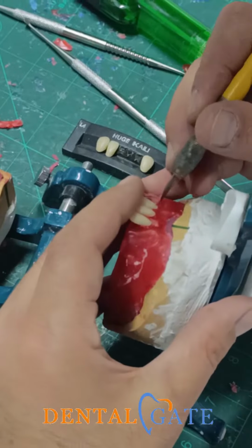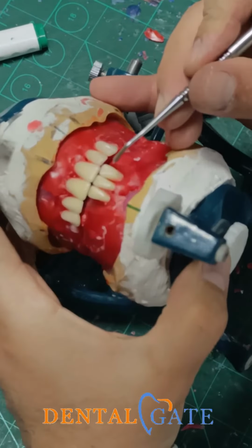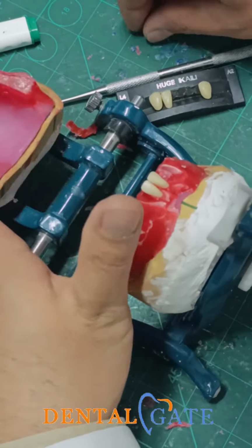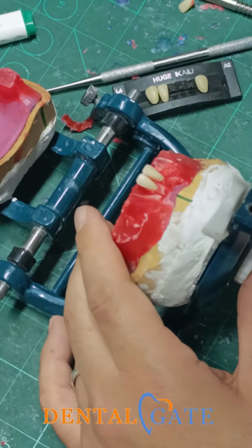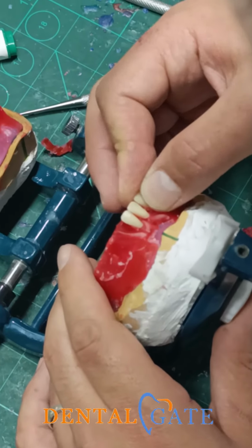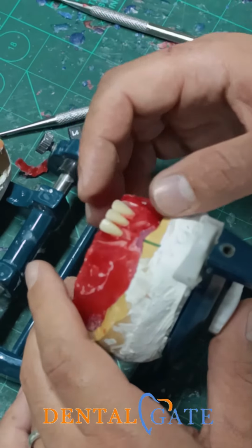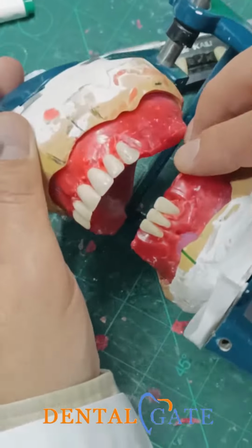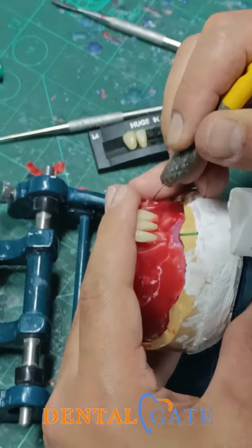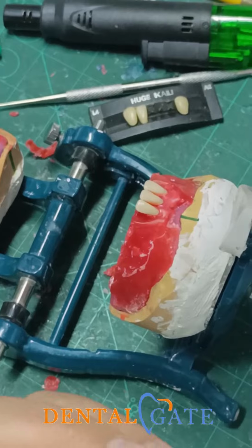Regarding the lateral, I had a mistake here. I will make a correction to the contact area. So I put another amount of wax and put the lateral incisor according to the criteria. It should be within the contact area, and it should preserve the same overjet that will be performed in the central incisor. What does that mean? I need 1 millimeter.